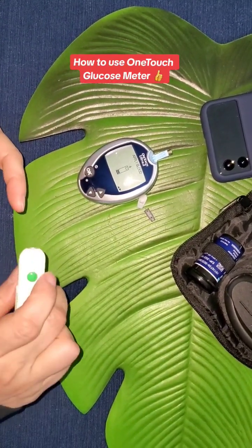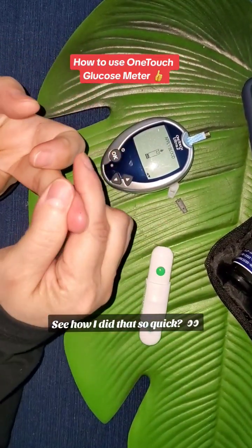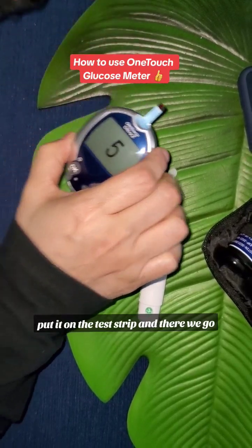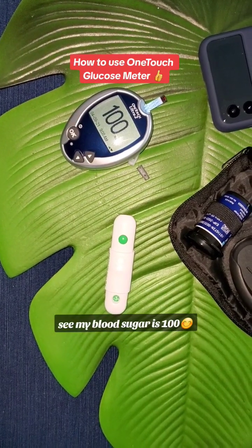Now I just press this little button here, ever so gently and carefully, very quickly — see how quick? Boom. Squeeze, put it on the test strip, and there we go. My blood sugar is 100.